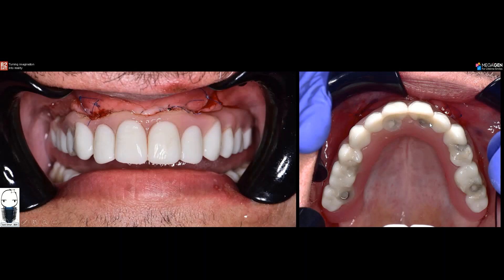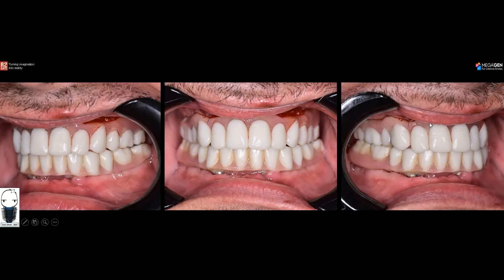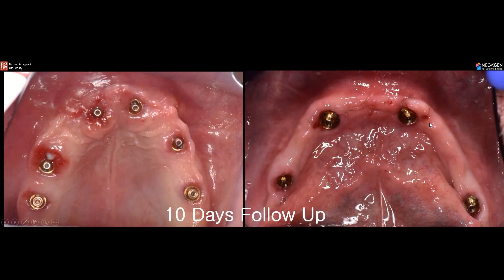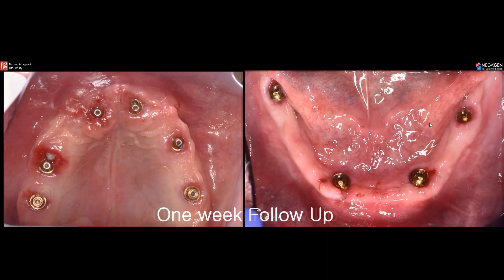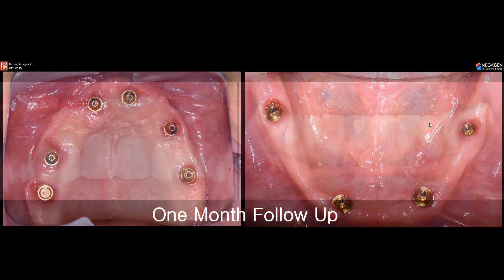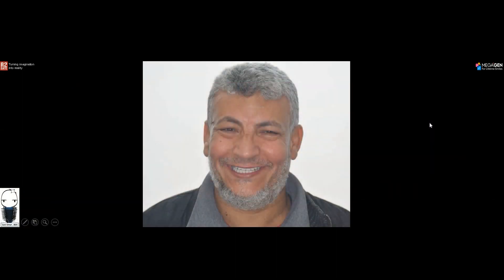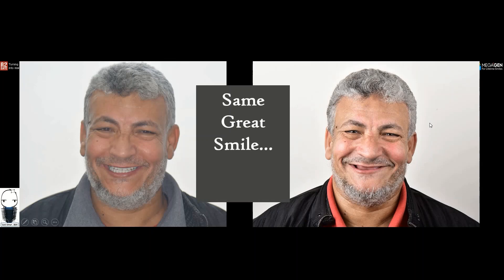Immediately after delivery of the prosthesis, everything looked great — the denture was picked up nicely in occlusion and we ended up with very nice occlusion. The upper and lower were done one week apart. This is a 10-day post-op and a one-month follow-up of the upper and lower case together. This is what we were able to accomplish for our patient — he had a beautiful smile to begin with, and we just added a small twist.